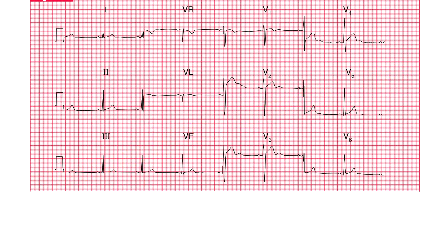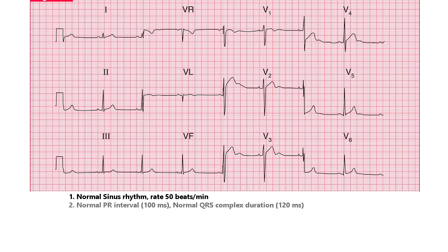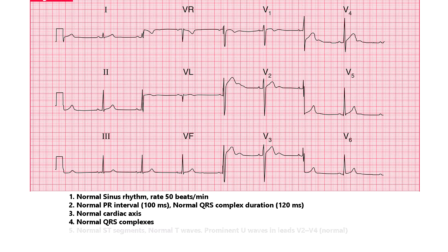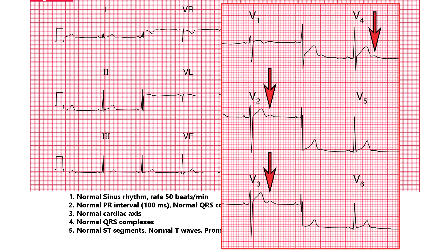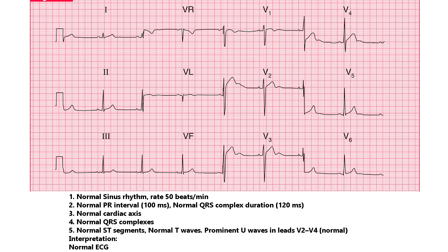Here is a variant of a normal ECG. We will report it as: normal sinus rhythm, rate 50 beats per minute, normal PR interval, normal QRS complex duration, normal cardiac axis, normal QRS complexes, normal ST segments, normal T waves. Prominent U waves in leads V2 to V4. Interpretation: Normal ECG.